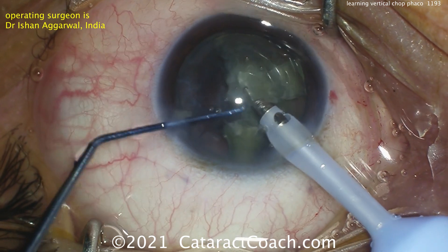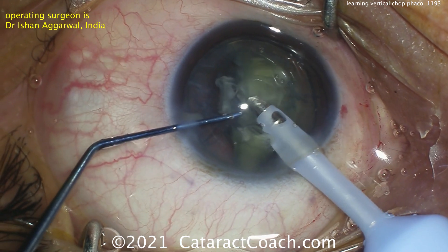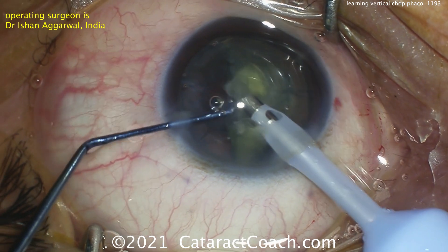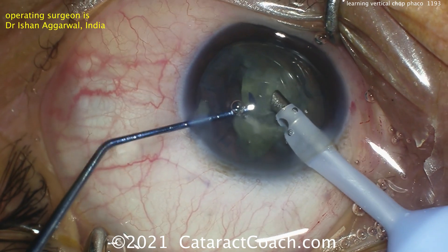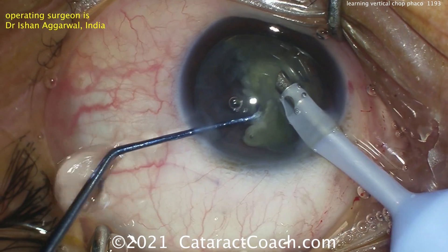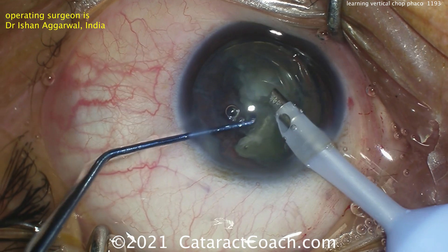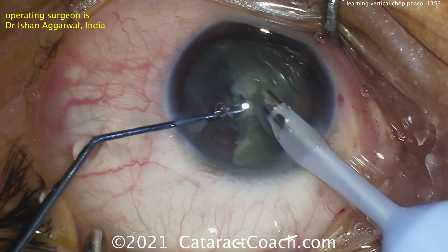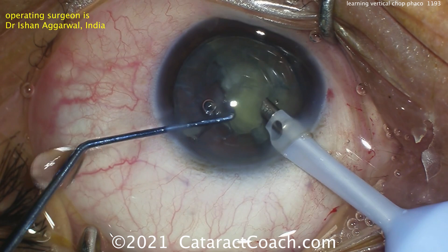Taking these last ones out, you can see the capsular bag. There's still one heminucleus remaining. These small fragments should come out pretty quickly and pretty easily. This looks like the surgeon is sitting superiorly and doing a left eye. Draping's good — no lashes in the field. Good exposure, eye staying in primary position.